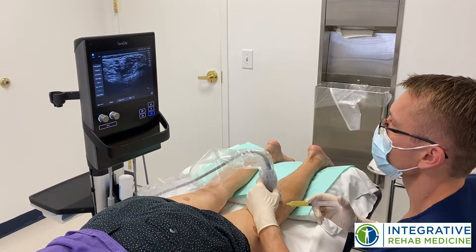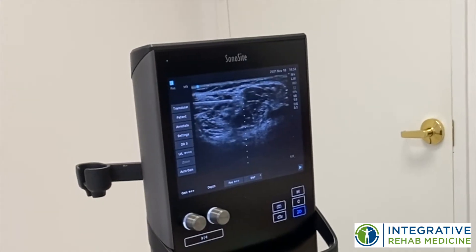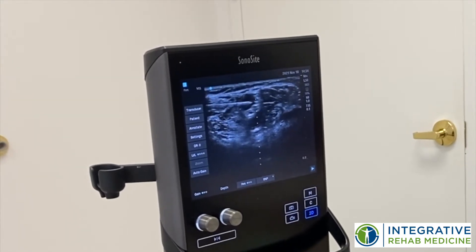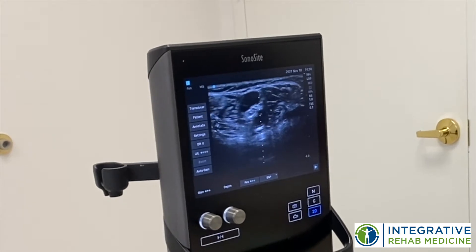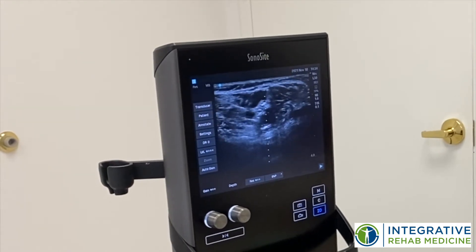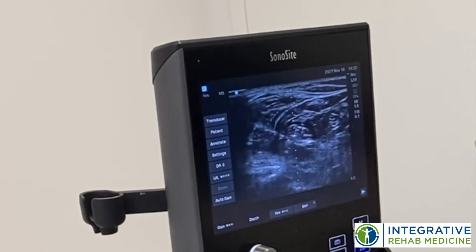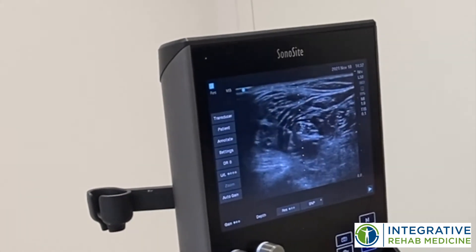We're going to inject some PRP around the tibial nerve, and again you can see the needle right above the nerve. Now it's separating the nerve from the tissue above it. I'm going to go a little bit underneath it. You can see the plasma completely surrounding the nerve.